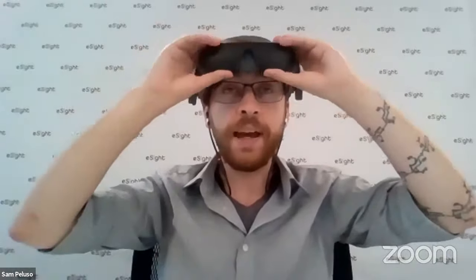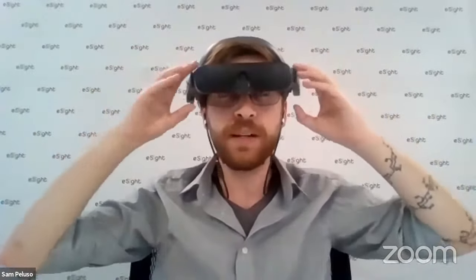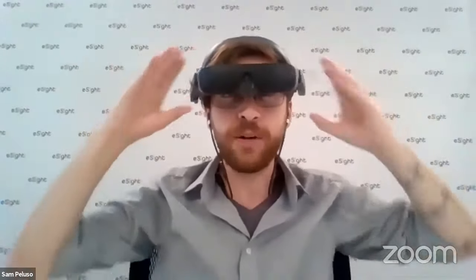I've never noticed the one that we've had get unusually warm or anything like that. So, yeah. The Esight 3 would get quite a bit warmer than this one. There was a spot on the top where we had to say, don't touch that. There's nowhere on this where it gets so hot that you can't touch it. Okay, so even if you grabbed right at the top there, you'd still be totally fine. Yeah, I can grab this and it's totally fine. And my device has been on for a bit of time. The device shoots the heat out of all around it now instead of just the top, which is what the Esight 3 did.